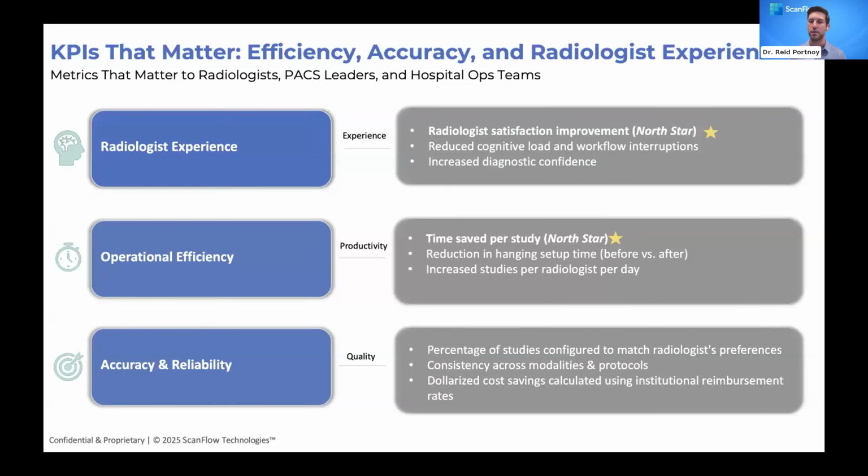Percentage of studies configured to match radiologist preferences, consistency across all modalities and protocols, and dollar cost savings calculated using institutional reimbursement rates.